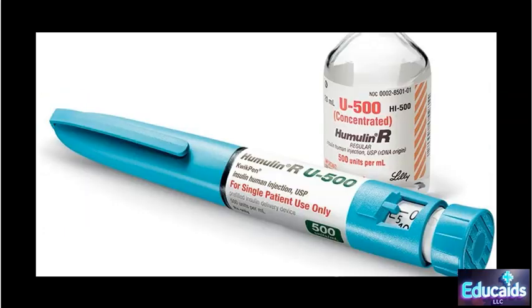And then we don't see this too often. Again, this is for our diabetics who are really struggling with control, this is ultra concentrated. This is 500 units per ml. It does come in a pen. This is the only pen that has this color. So if your patient brings in their med and you see this, then that should be a red flag for you that you really need to be careful transcribing their meds and let the provider know.